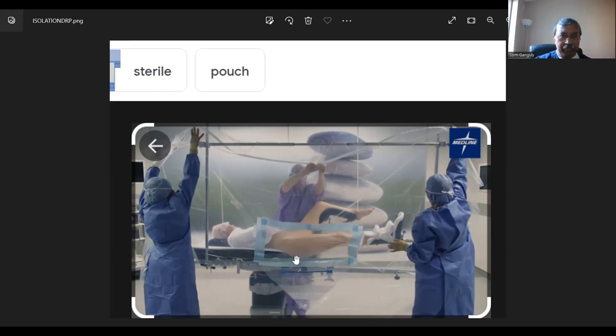The buttock is hanging. There is a post going in the groin area in between the legs to stabilize the patient. That is why this post is not letting the person slide down. The affected leg is on a leg or foot holder, properly aligned so that the fracture is managed or reduced, and the non-affected leg is abducted and placed on a leg holder away from the affected leg.